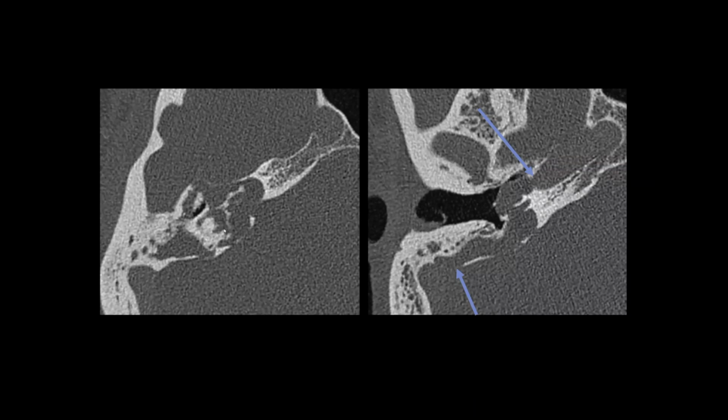It's eroding into the inner ear structures here. Over here on this image, this is the cochlea. And so you can see it's eroding into that, eroding the bony covering of the carotid canal over here, as well as the sigmoid plate bordering the sigmoid sinus over here.